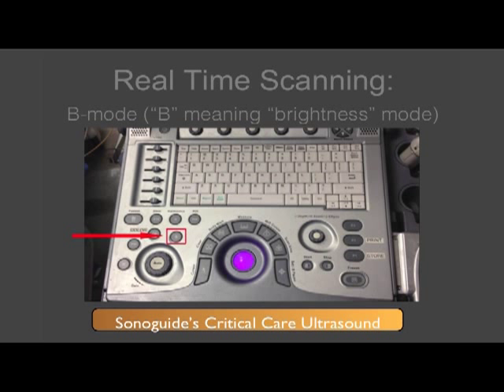You will then need to select the proper imaging modality. This is a version of the GE Logic ultrasound machine. However, on any ultrasound machine you are using, it is important to select the B or brightness mode in order to perform real-time scanning. This is also known as 2D scanning depending on the model of the device you are using.